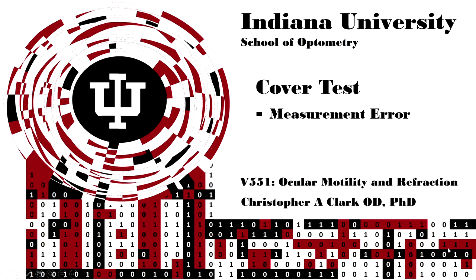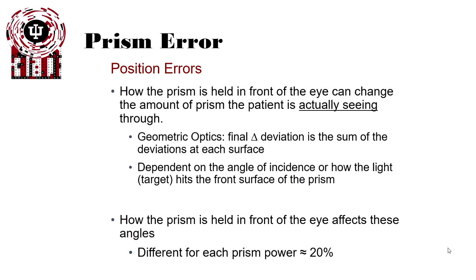This is cover test, measurement errors for V551 ocular motility and refraction. How the prism is held in front of the eye can change the amount of the prism the patient is actually seeing through. This is based upon geometric optics.